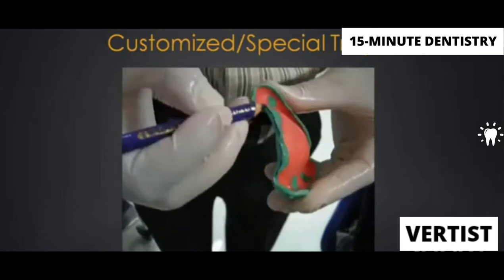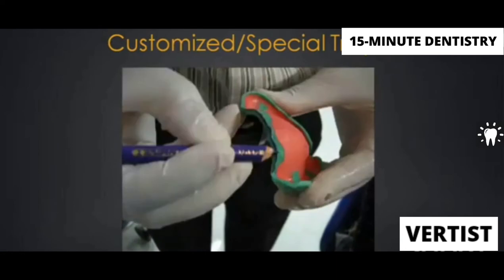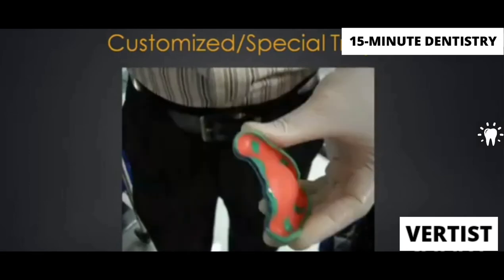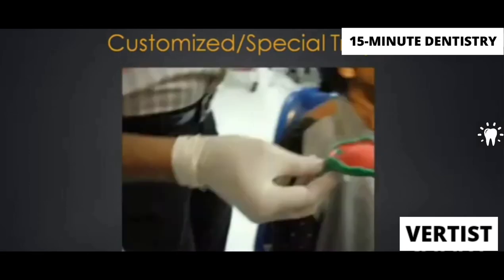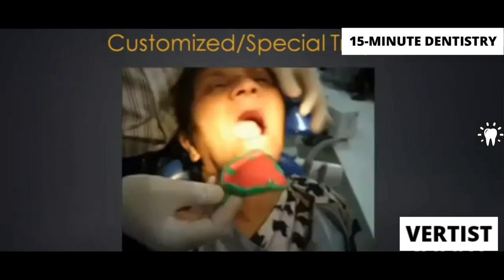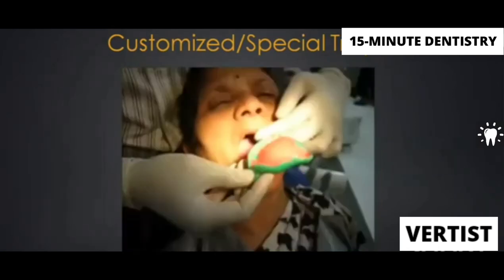For that, what we do is we mark on the custom tray itself directly. And then we place the tray in the patient's mouth. So this is a reverse way of checking whether our tray extension is correct or not.